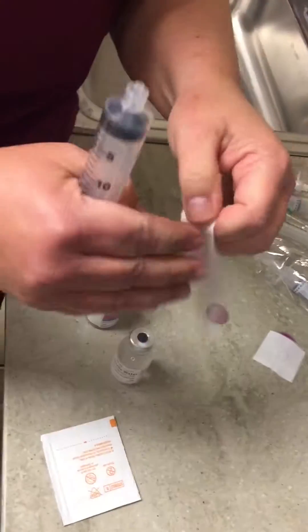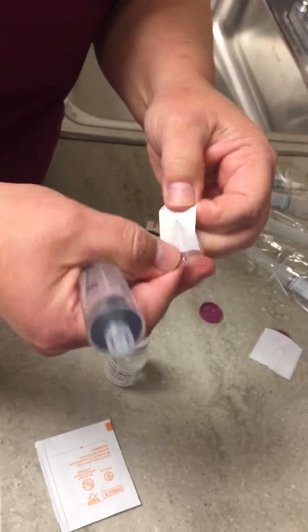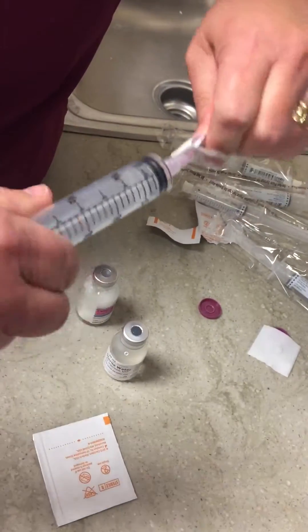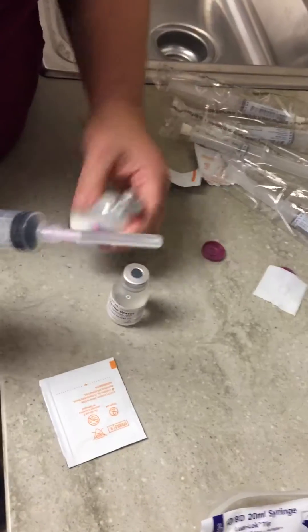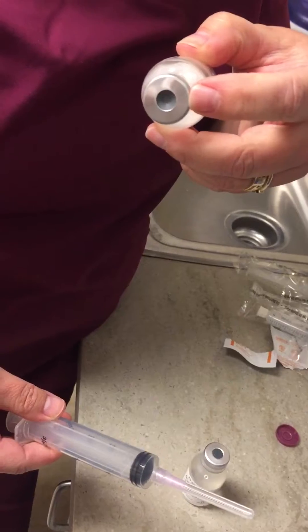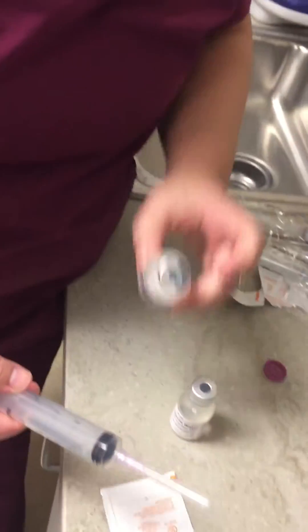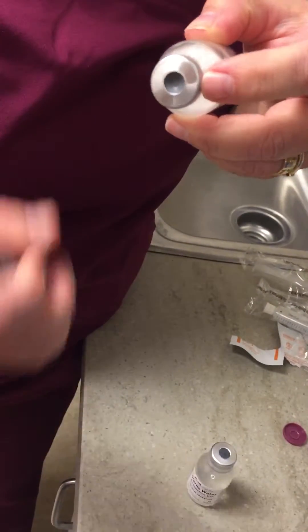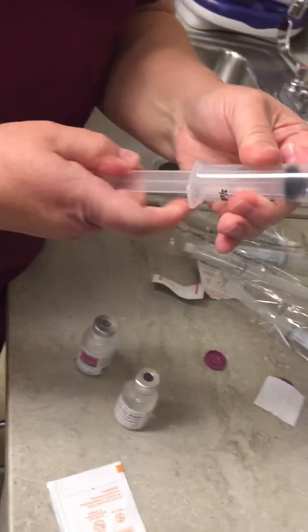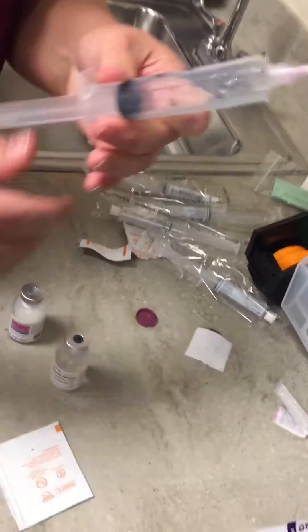I have a 20ml syringe, and here is my cefepime. You can see that this vial is already vacuumed because the rubber stopper is indented. So the first thing I'm going to do is pull up my 20ml of water.